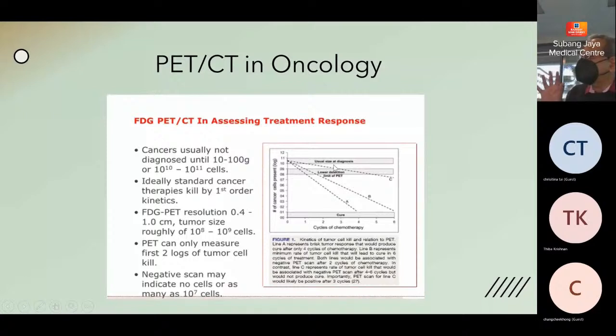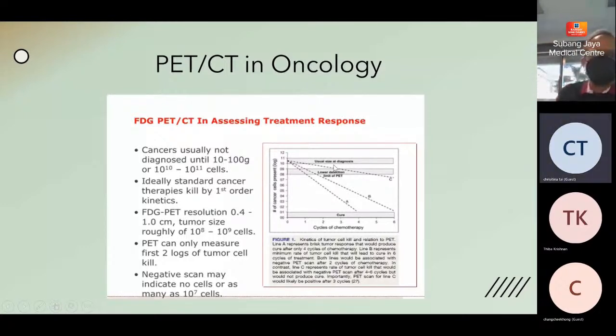So this is to guide the clinician, the oncologist, on recurrence. And I think the interim scans in PET is very useful in the sense, basically based on this particular tumor kinetics that we see using PET.